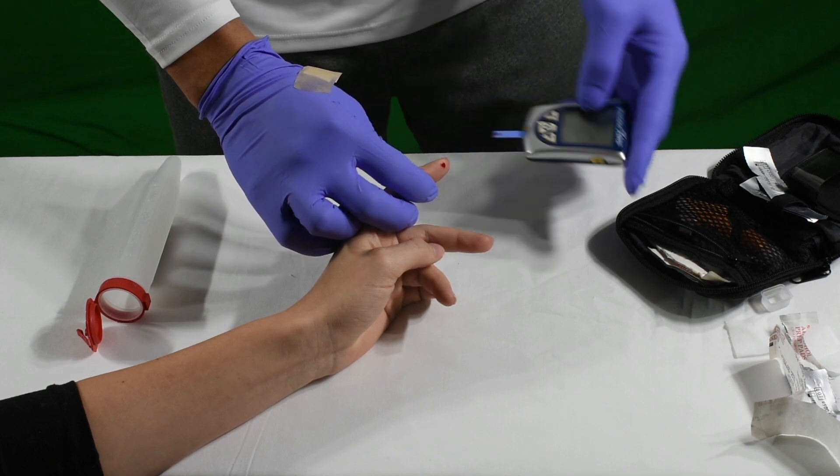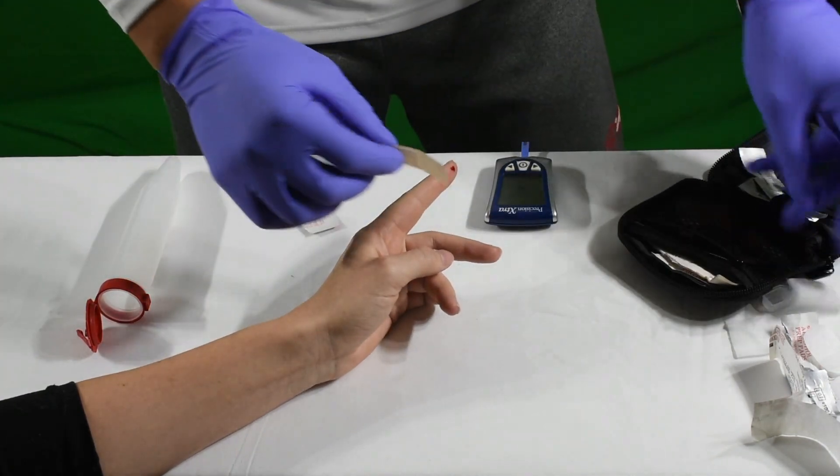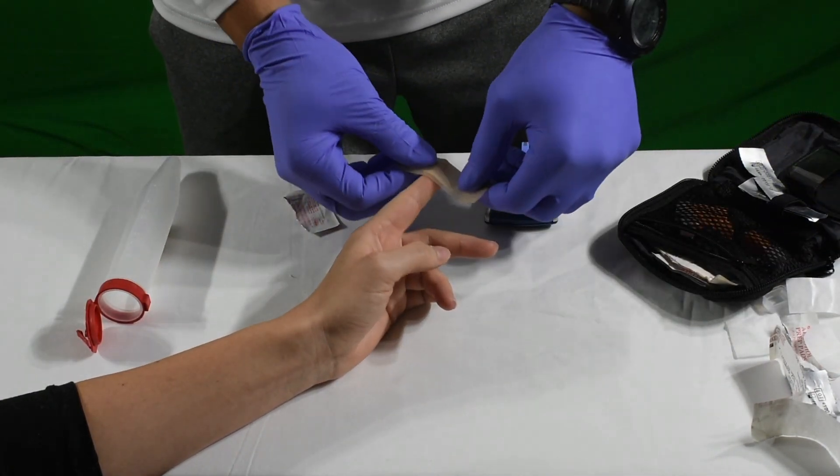Do you hear that beep? It's going to take five seconds to read. Grab the bandaid and put it on your patient.